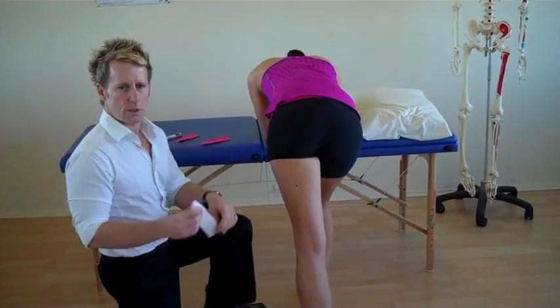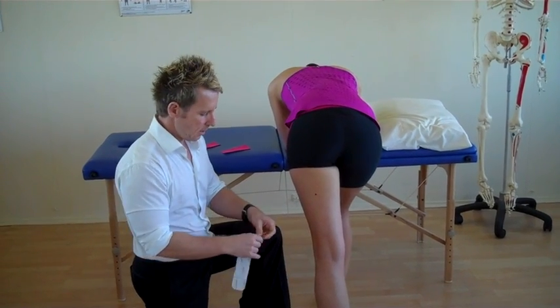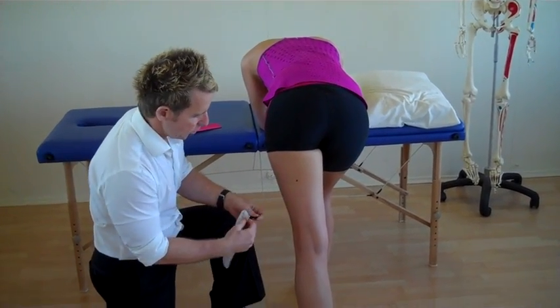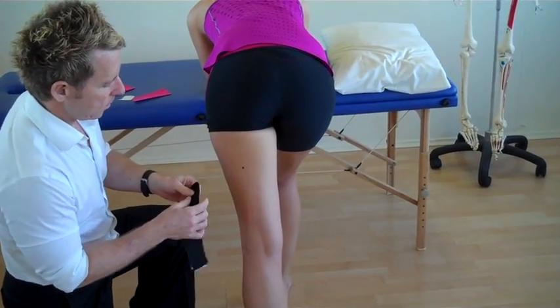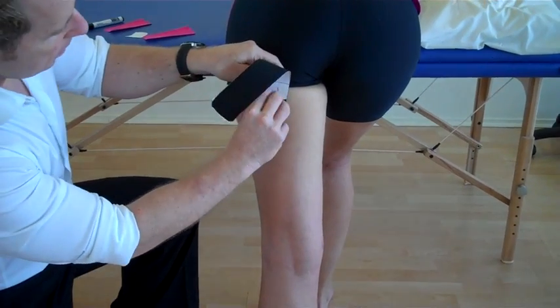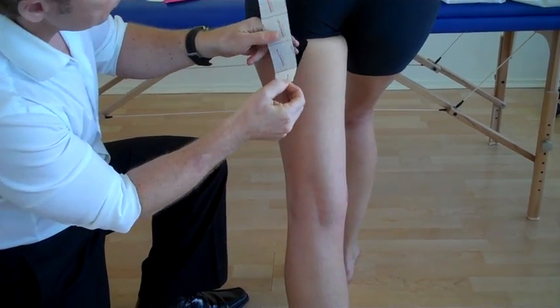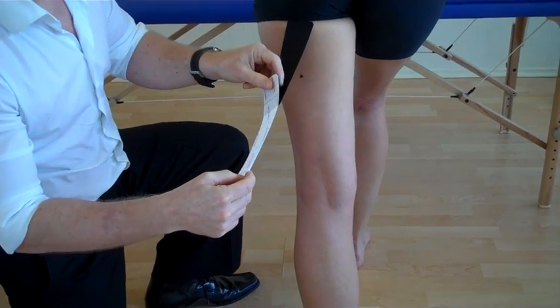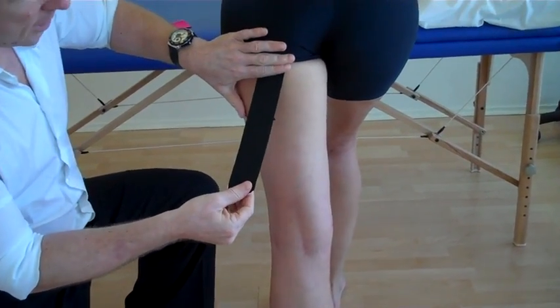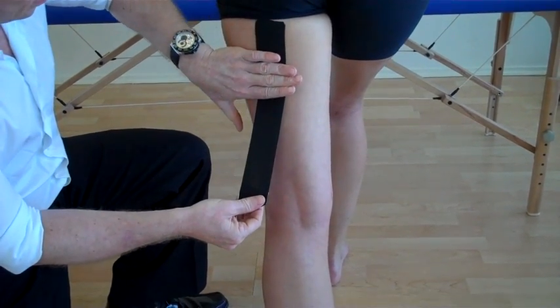So then you're going to use the first bit of tape — a standard eye strip that's being prepared. And then we're going to just split the tape. We've got the pain just here, so we're going to apply the tape above that area. Because the tissue is already on stretch, it means we don't really need to apply too much stretch to the actual tape itself. So we can apply a little bit just for the adhesion onto the skin there.